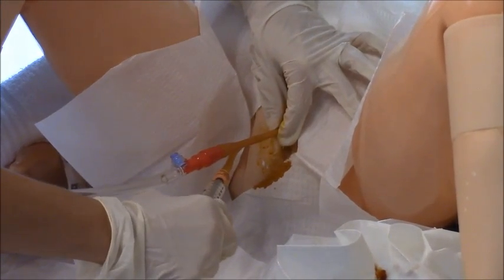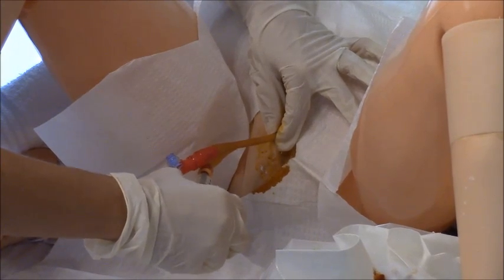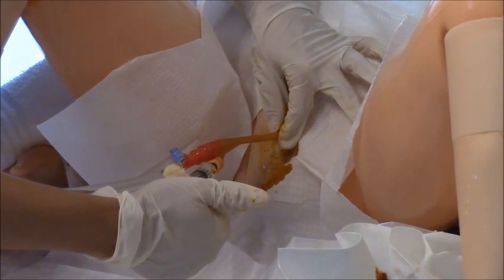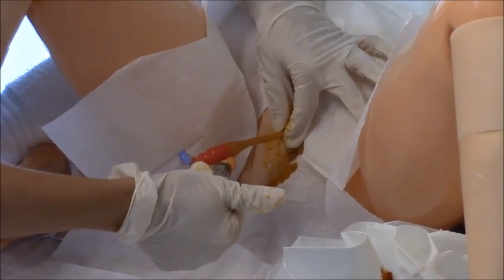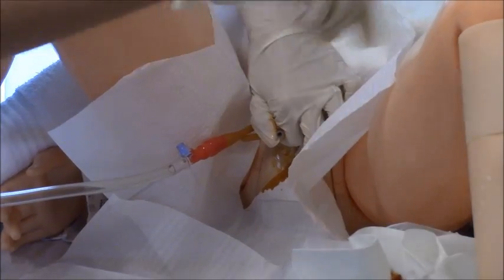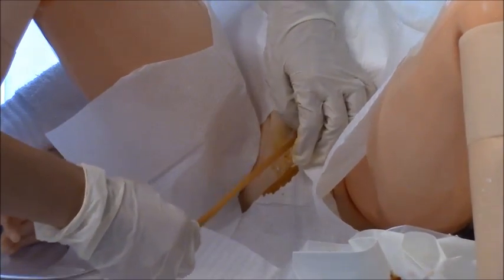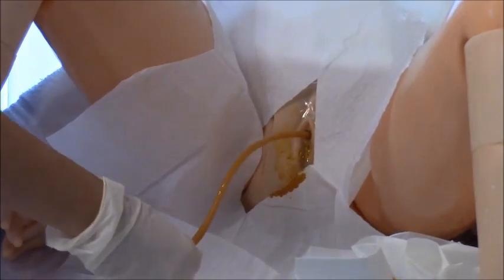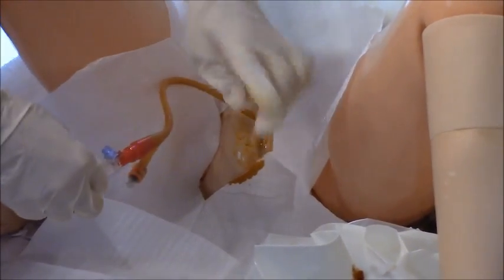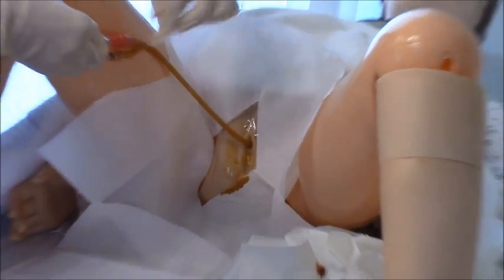Once urine return is confirmed and the catheter is advanced sufficiently, inflate the bulb. After the bulb is inflated, disconnect the syringe and place it in your trash. Then gently tug the catheter back — it will stay in place, held by the inflated bulb. You'll want to get one of the securement devices that attaches to the thigh to keep the catheter stable.